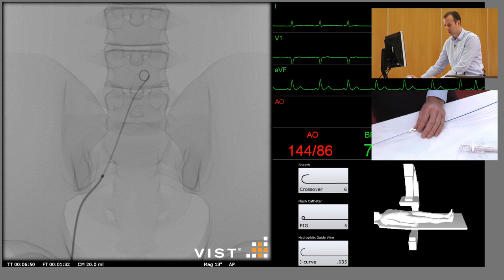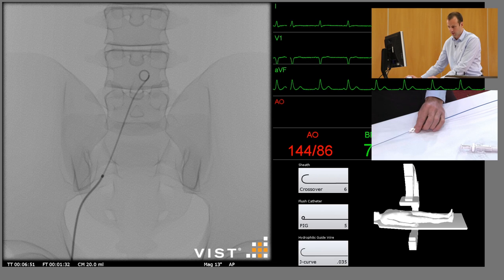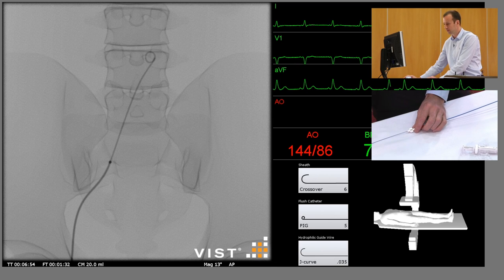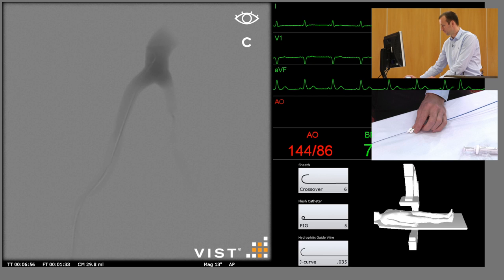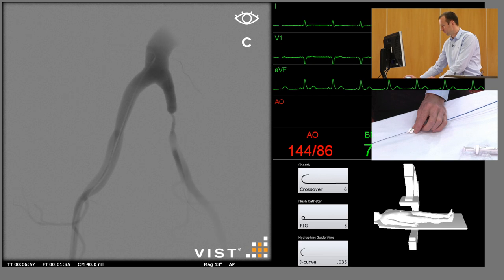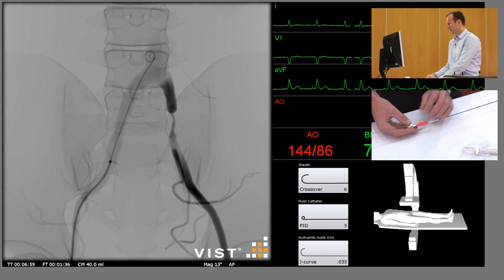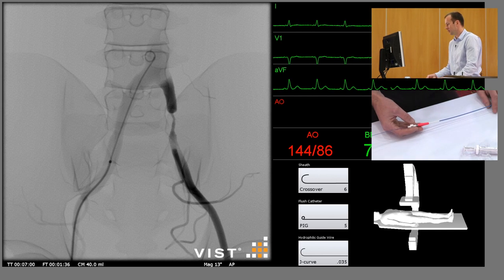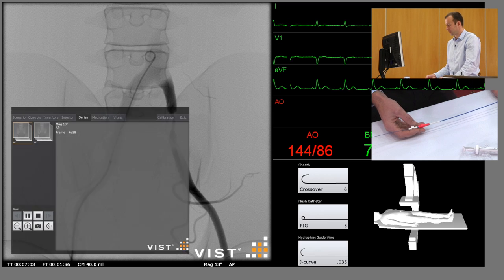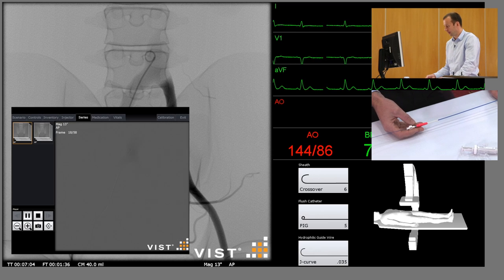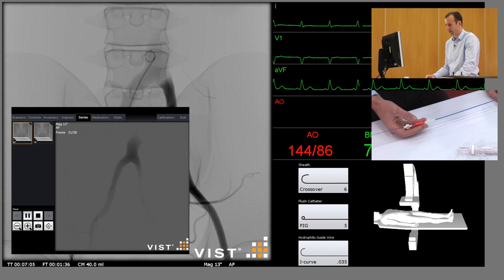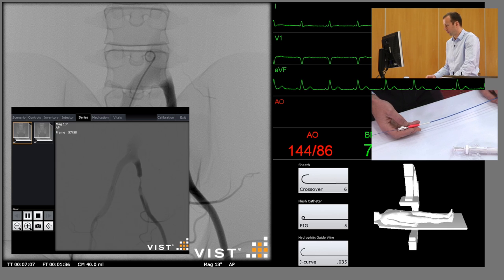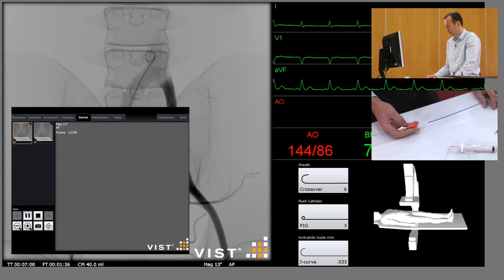We're going to inject 20 mils of contrast at 12 mils a second, and there we can clearly see a tight stenosis of the distal common iliac artery immediately above the bifurcation into the external iliac artery.